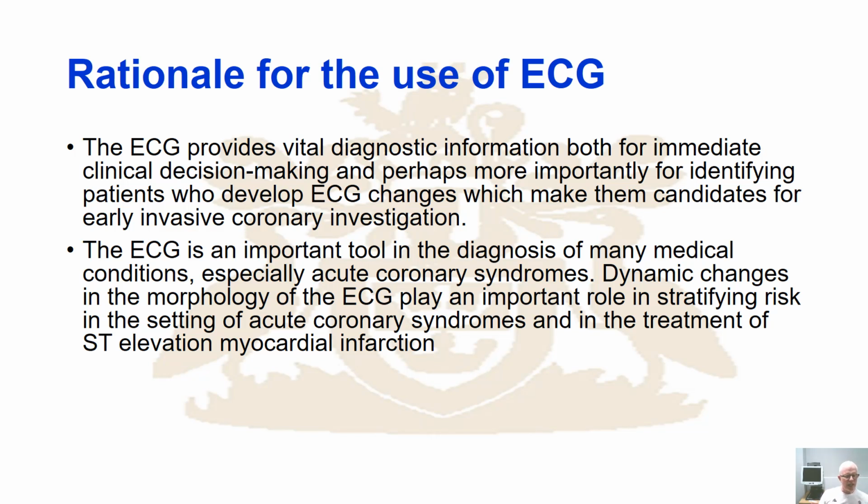And so if we monitor the ECG and we see a significantly, profoundly elevated ST component, it's probably an indication that the individual is either at the onset or into a myocardial infarction. So again, really lending itself to the role in a clinical setting.